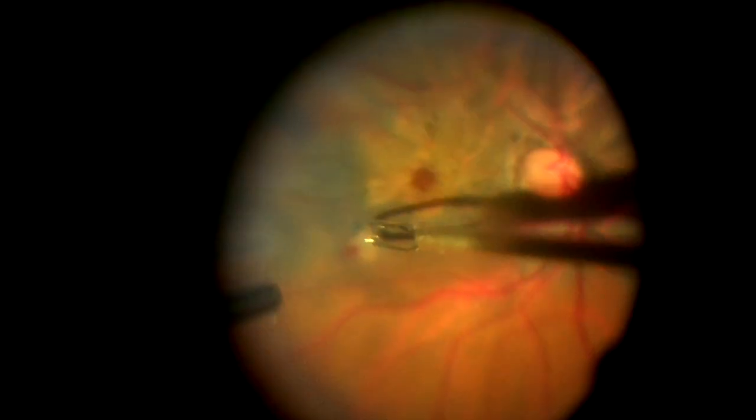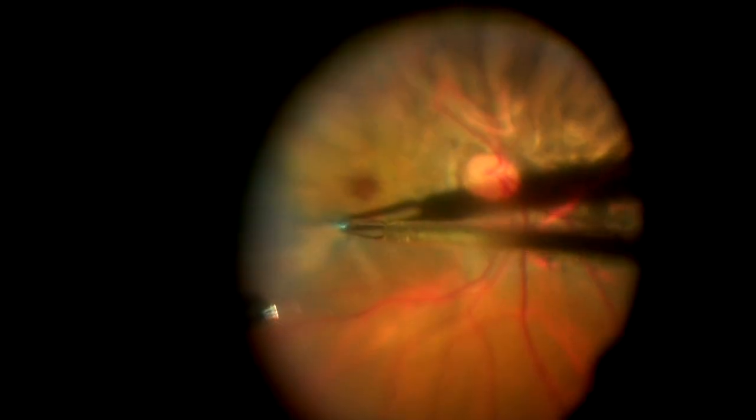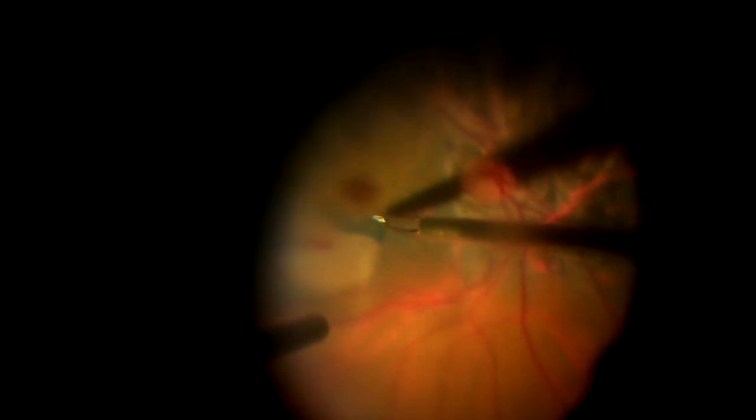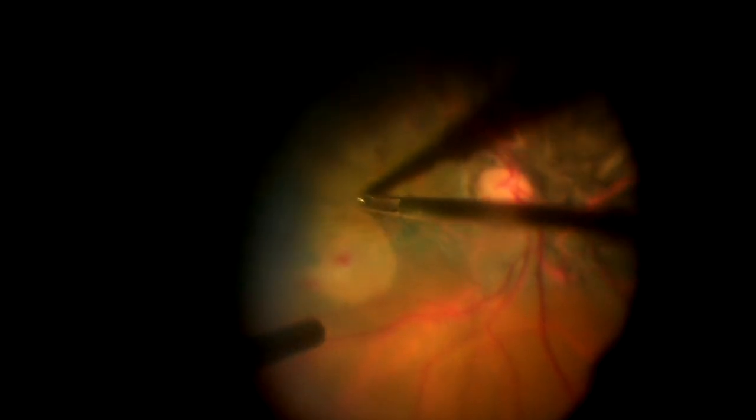So when you are close to the central fovea to take the ILM, there may be vessels which can get damaged. So generally try to grip the ILM away from the blood vessels. Here in this case, I am trying to make a flap and insert that flap into the hole, but you can see here that I lost the flap. So we can take the nasal ILM and then you can use it as a flap later.